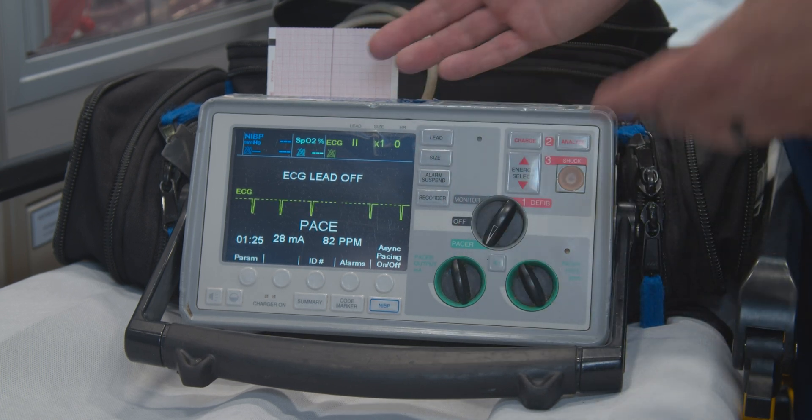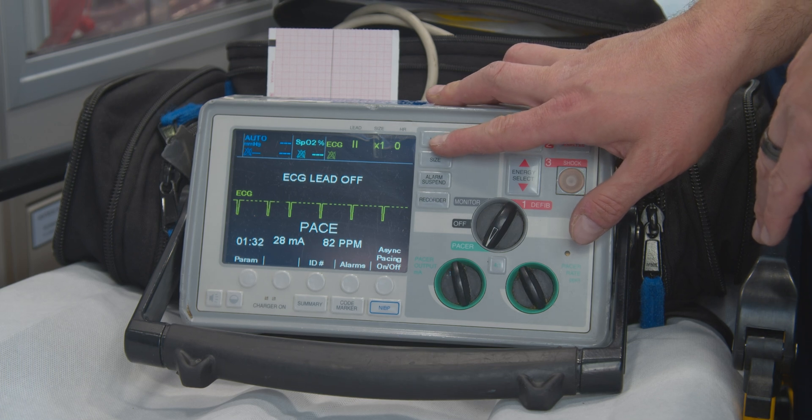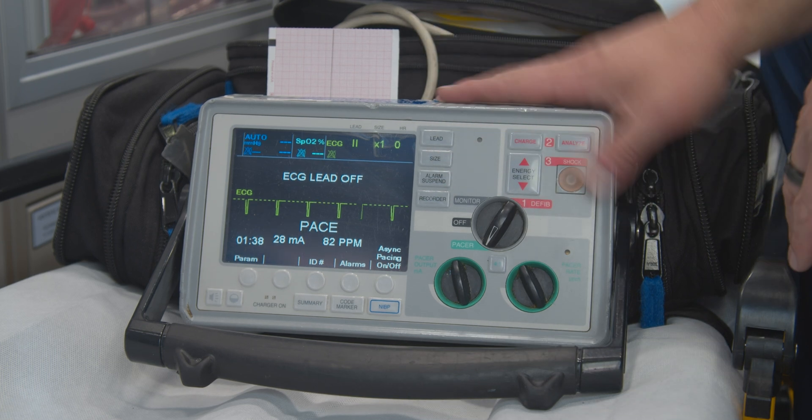And that's it for the basic functions here. If you want to switch through your leads, not a problem. If you want to change the size of your QRS complex, just hit size and it'll go up or down. Not a problem there.